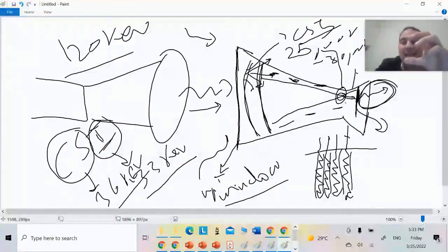Now, these light photons begin to be received on something called optical lens, a specific lens. This optical lens starts to transmit the light that translates my image into video, and on another screen, it appears to you as if it were a film. Let's take a look at this so you can visualize it.